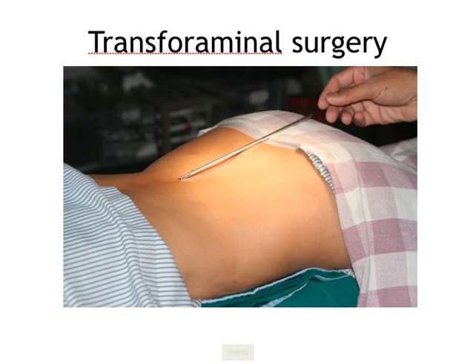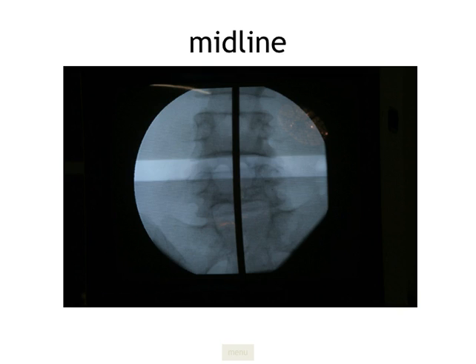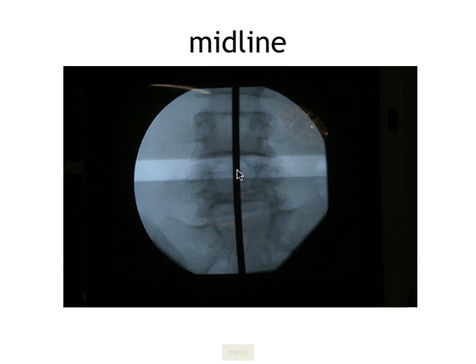We make the patient lie prone. I am standing on the left side of the patient; the patient's head is on this side, legs are on the right side of the picture, belly down and back up. I mark the midline by placing the marker on the back of the patient and looking at the fluoroscopic image. When I mark this midline, the image shows the marker situated exactly in the midline — both pedicles equidistant — giving a true AP picture in fluoroscopy.